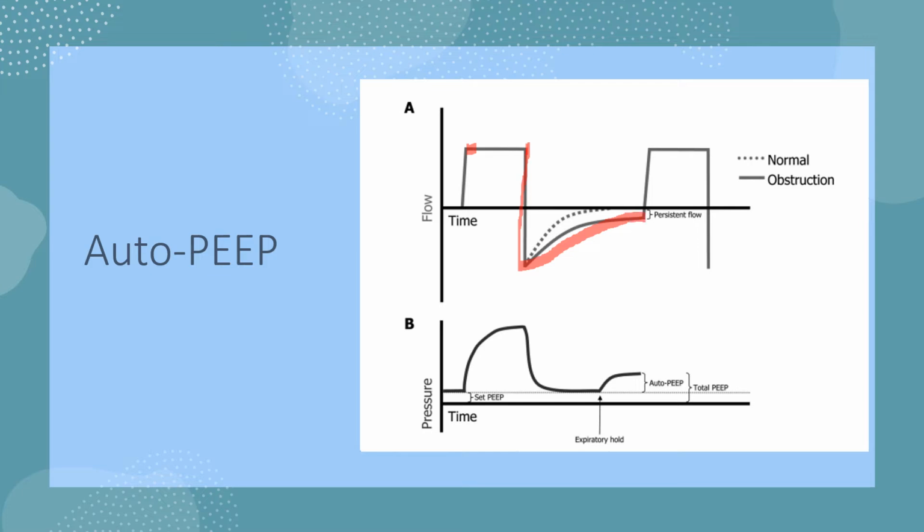And then here a new breath is delivered. I wanted to show you when that new breath is delivered below this axis line right here, and you can see the breath coming in straight up here, they have intrinsic PEEP. That is called auto-PEEP, and that could be what is known as air trapping.